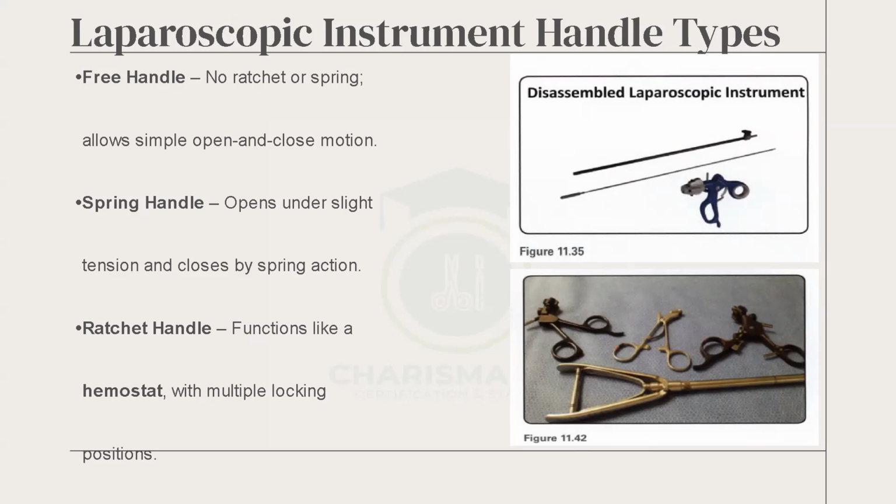So you test the insulation for cracks. You check the tips of the metal one, in the middle, for bioburden, because the tip is where it's used. Then you check the handles for any cracks, any bioburden, any loose part. On the handle, I want them to see the pin, where the electrical part is connected.